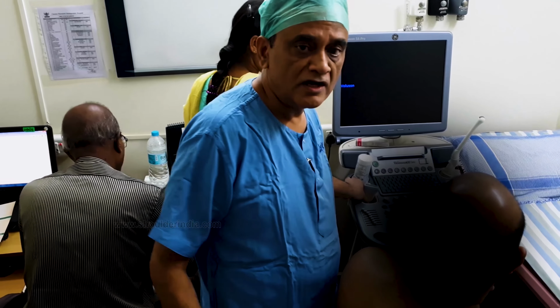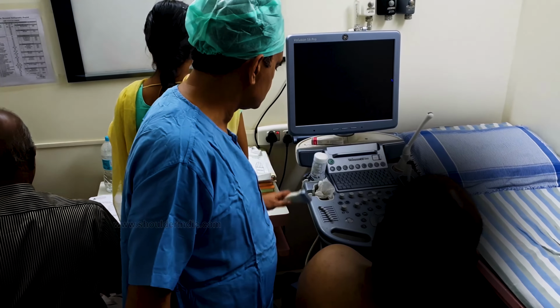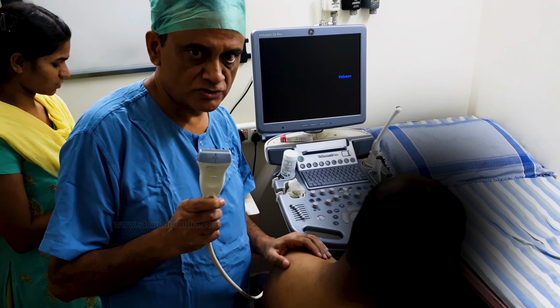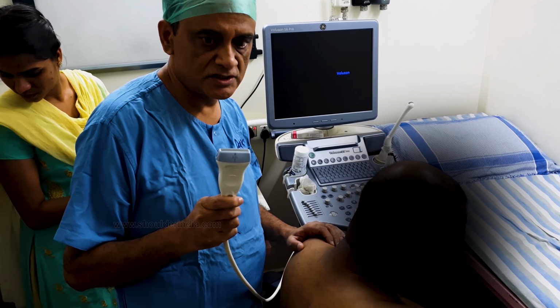Watch this please. Hello. Now I'm going to show you how the ultrasound works. This is the ultrasound machine. This is a probe. This is used routinely for musculoskeletal ultrasound. Its frequency is 12. So what are the substances that I inject?